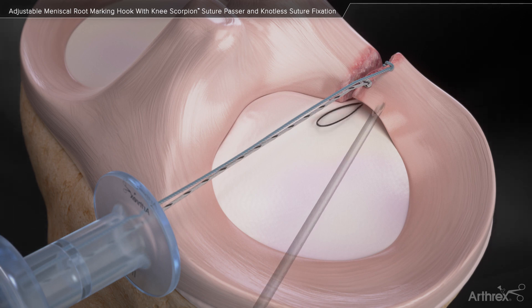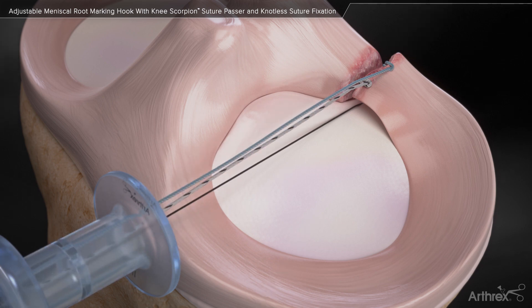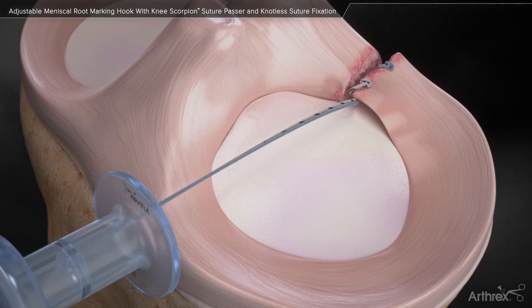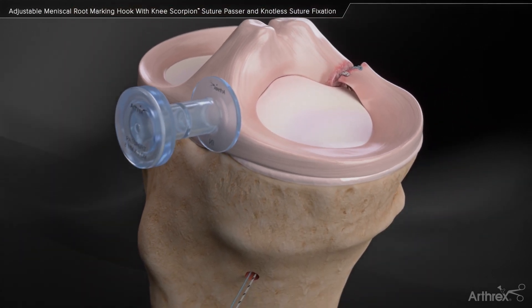Introduce the suture lasso needle through the drill sleeve. Load the two sutures into the loop of the passing wire. Secure with a swivel lock.